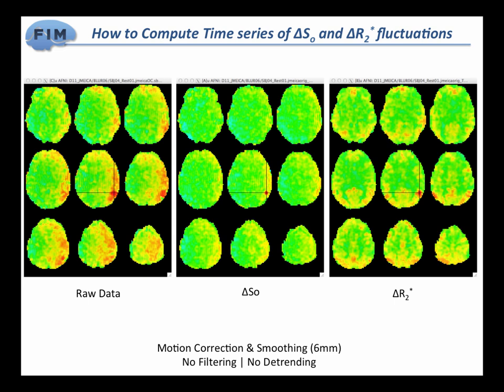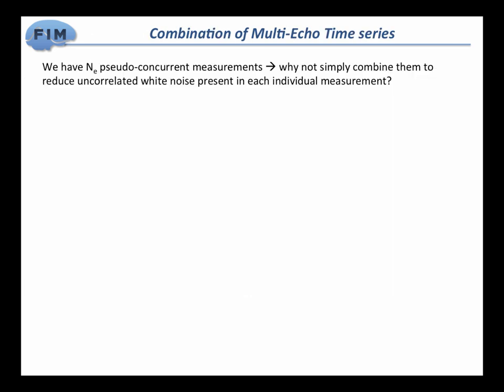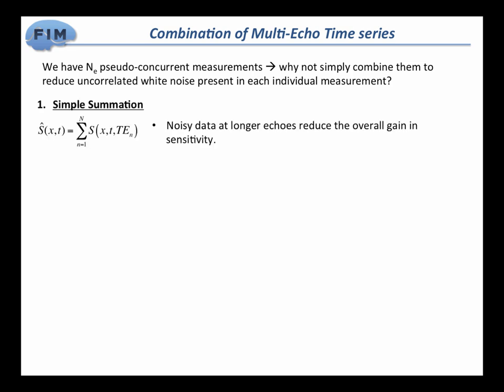That's one way of doing things. As I say, it's not the optimal way, and I wouldn't do it with 3 echoes. Okay, I'm using here a kind of a good example. Another thing we can do is simply to think, okay, suddenly I have 3 time series instead of 1. The theory tells me that when I have 3 noisy measurements of something, if I combine them, I tend to get a better estimate of what the actual value that I'm measuring is. And people have done this.